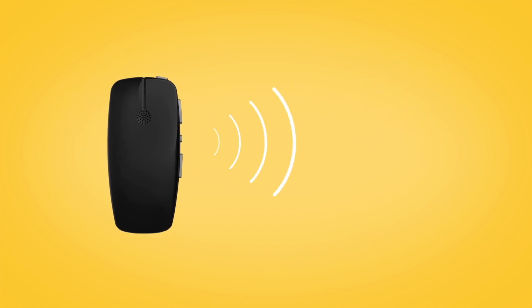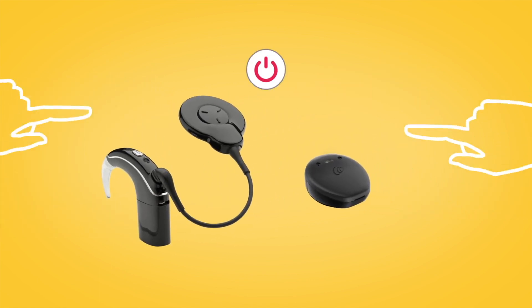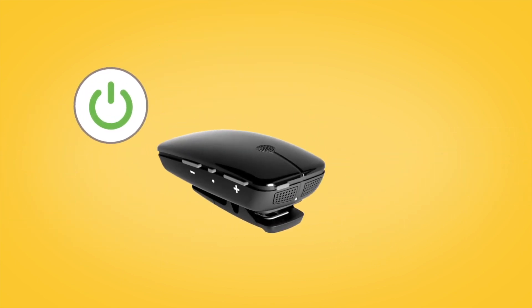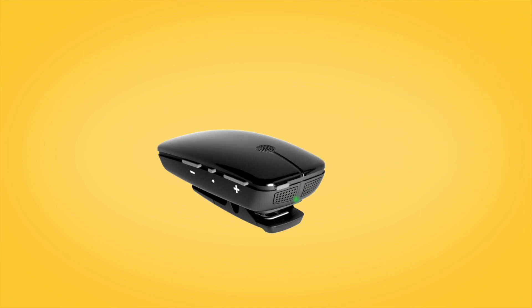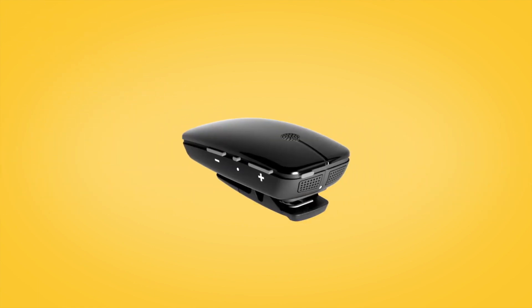To pair your Mini Microphone with your Nucleus 7 or Kanso 2 sound processor, remove and turn off your sound processor. Then power on your Mini Microphone by pressing and holding the on-off button for two seconds until the LED turns green. To begin pairing, gently press the pairing button on the back of the Mini Microphone using the tip of a pen or similar object. The LED on top will blink yellow every two seconds for 20 seconds to indicate it is in pairing mode.